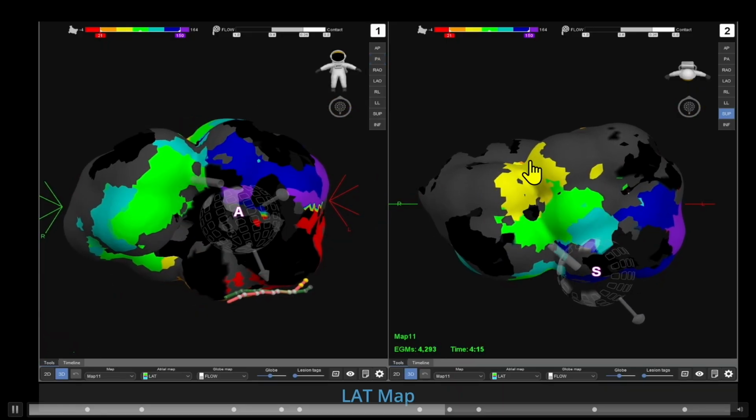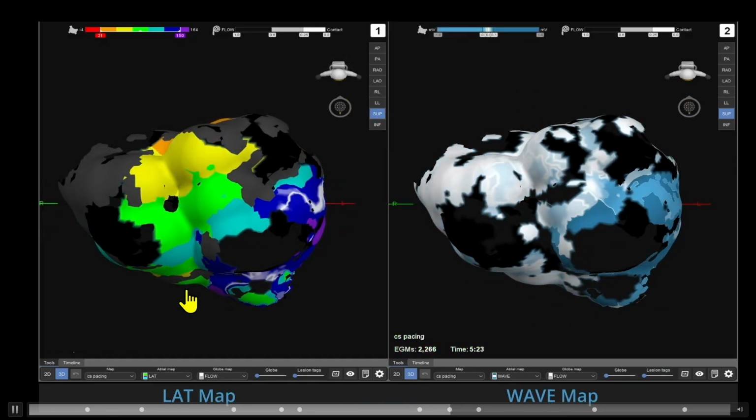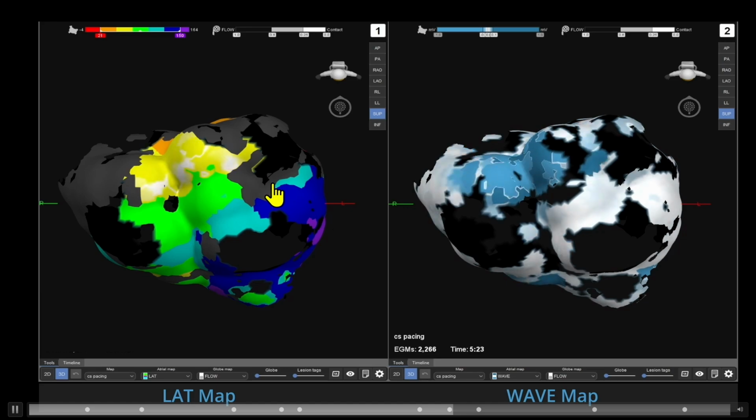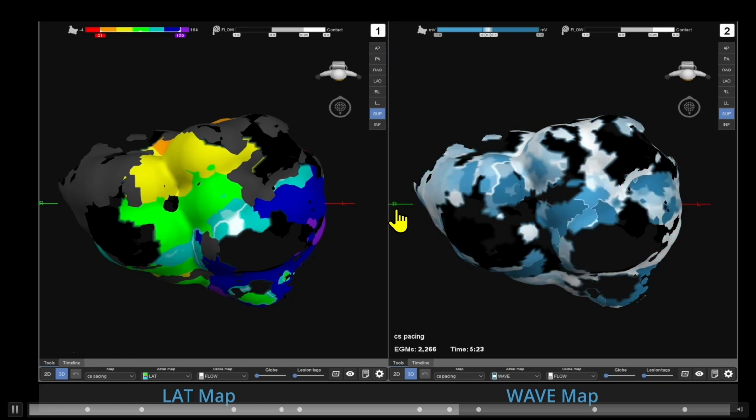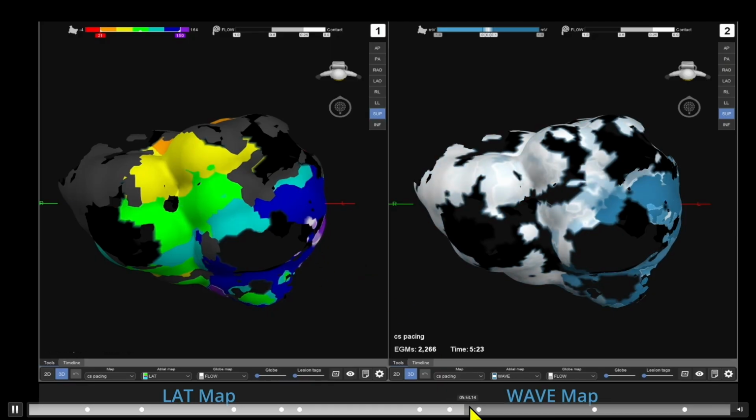So this is an anterior view. This is a top-down view. This is anterior, and this is posterior. And we can see the activation. And the other view that they like to show is sort of the global view, which you're going to see in just one second. Because it's a little weird, but I'm starting to like it.